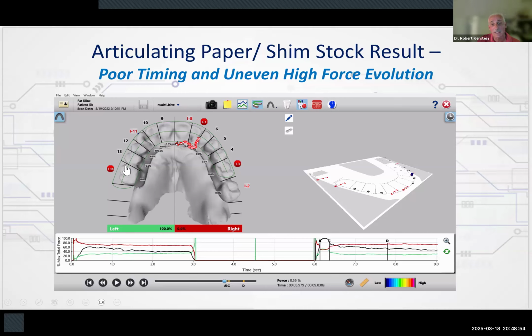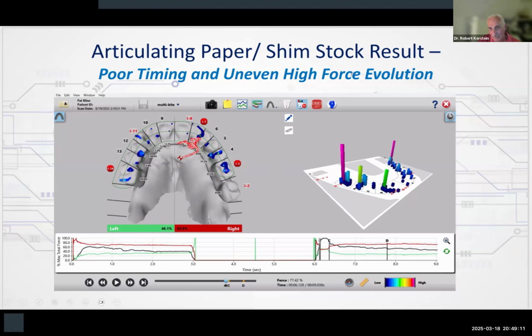Well, here's the T-Scan data of this case. There's an STL file of the prosthesis underneath. There are 3 implants under overload warning, which is another great feature of the T-Scan. Watch the timing of this. First, the anterior right is too early. Then the posterior right is too early. Then the middle of the right is next. And then the left is late.